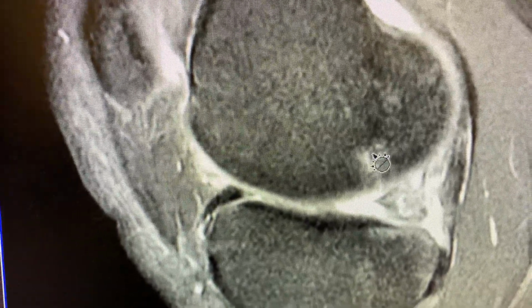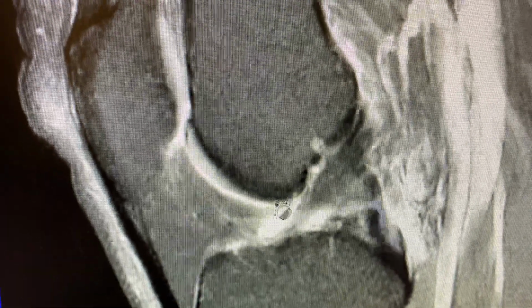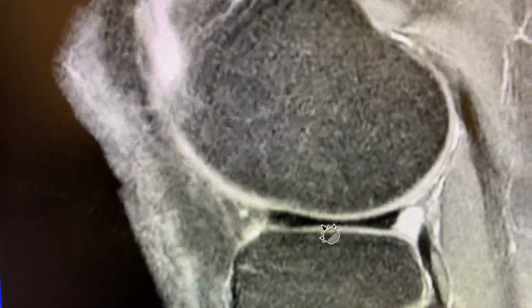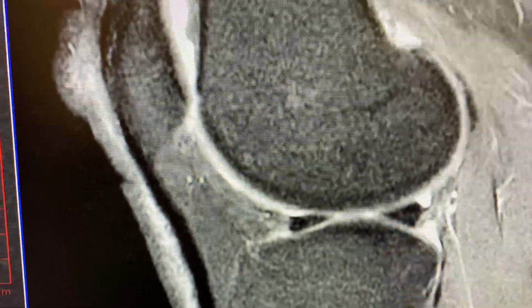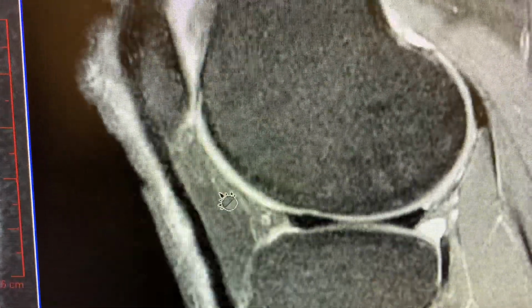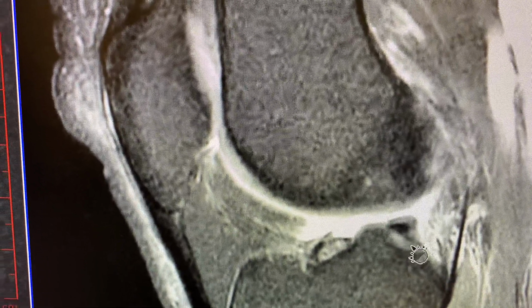There's some edema over here as well. And once again, there's a PCL, and there's the ACL. And let's go ahead and look at the root of the lateral meniscus. Here's a lateral meniscus. Follow the posterior horn. And there's where it attaches, which is fine.